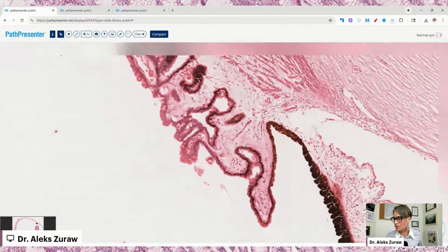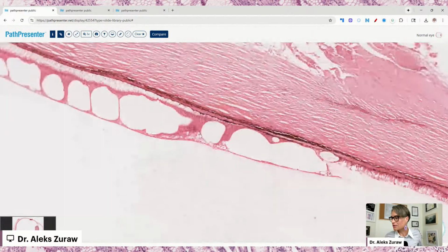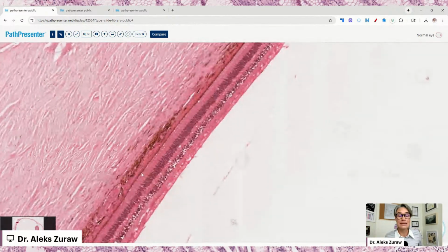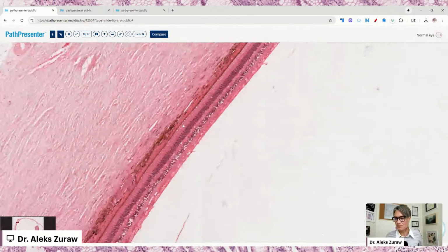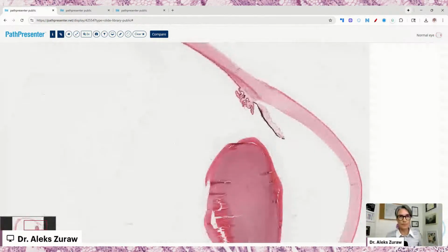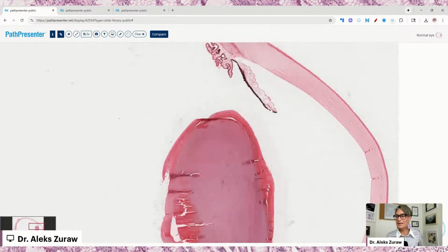I mean, it's continuous with the retinal pigmented epithelium, and it's going to go all the way to the back, to the retina, and that is our layer that's going to accept light and translate light into what we see in the eye. But going back to the iris, the iris is going to be the thing that gives the color to your eye.